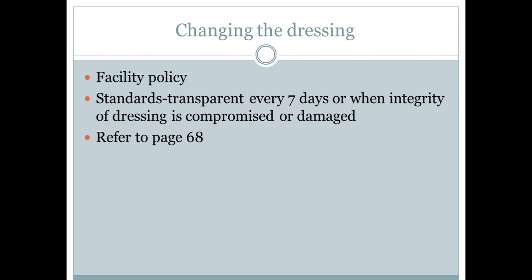After you wash your hands, obviously you're going to have all your stuff right there in front of you because that IV is going to be in place. You're going to want to hold that catheter in place with your non-dominant hand just to prevent any movement or dislodgement of the catheter. Also be careful not to manipulate it too much. You're going to gently remove that tape and any of the dressing you have with that. The StatLock also is going to come off and be changed when you do your dressing changes.